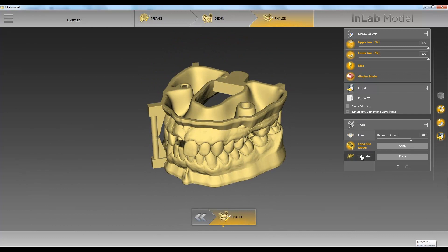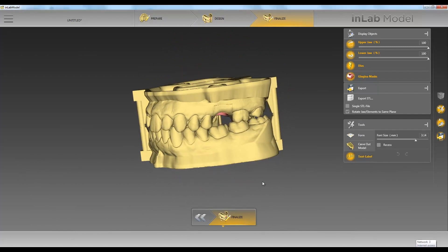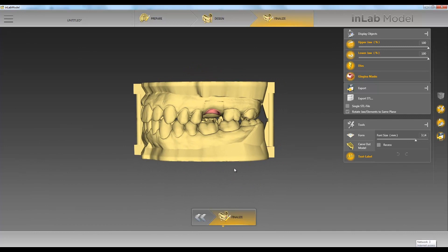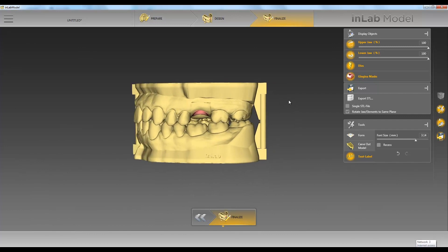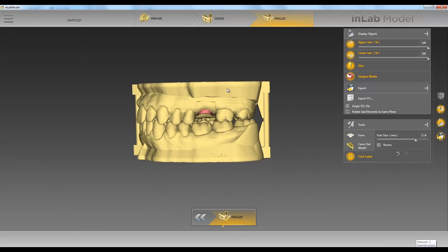Next we can add text and place it wherever you want. We usually put the patient's name and PAN number.